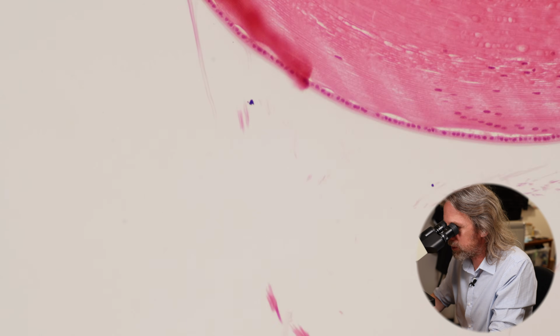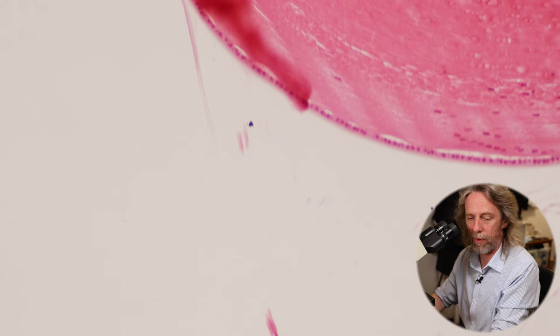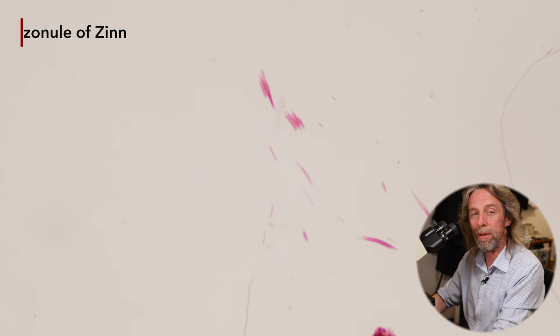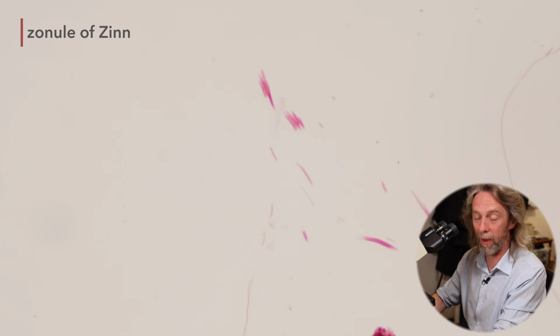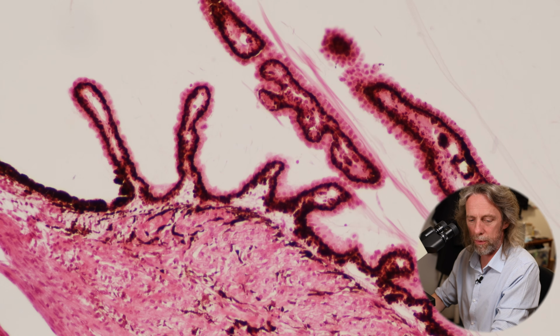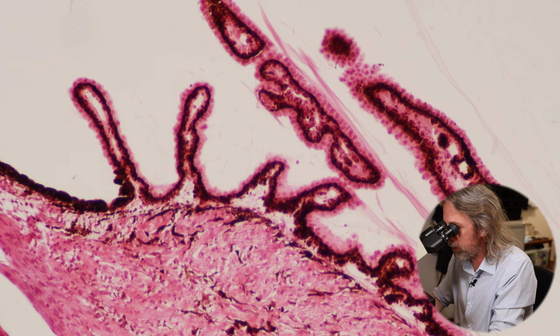You see those little wispy lines in there? So those are the suspensory fibres linking the lens to the ciliary body. One of the best names in the business, the zonule of Zinn. But we don't call it that anymore because we use contemporary terms. So the ciliary body then has got a number of features.